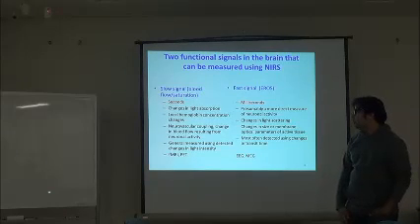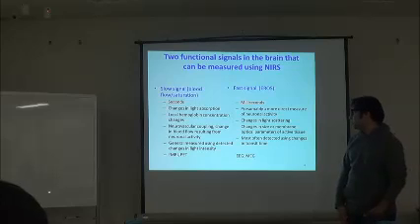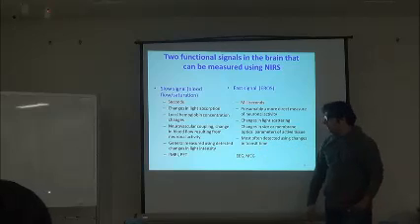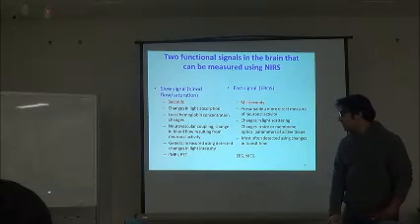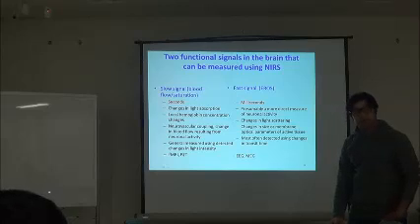detects the local hemoglobin concentration changes, changes in blood flow resulting from neuronal activity, and it is generally measured using the detected changes in light intensity, not the transit time. Well, the slow response is quite comparable to that by fMRI and PET.